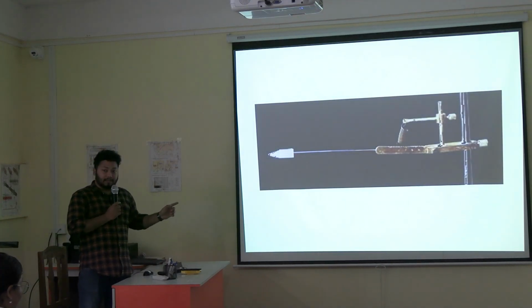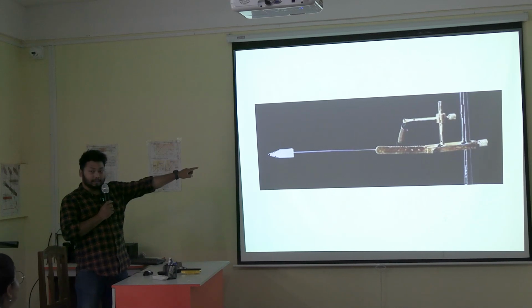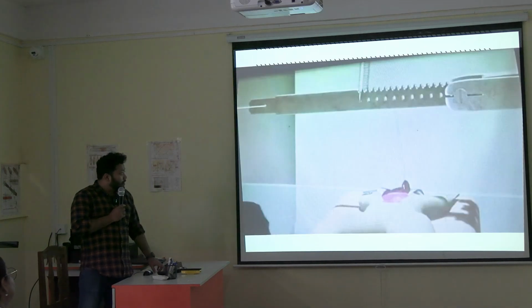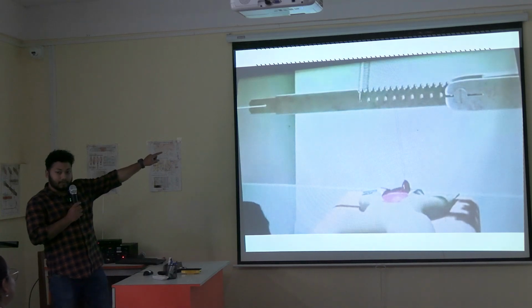This is Starling's lever. Okay? How will you distinguish between this and the normal one? You can see there is a pin and a spring there. Okay? Now what will we do? We will take that hook, and with the thread we will tie it to this part of the lever.